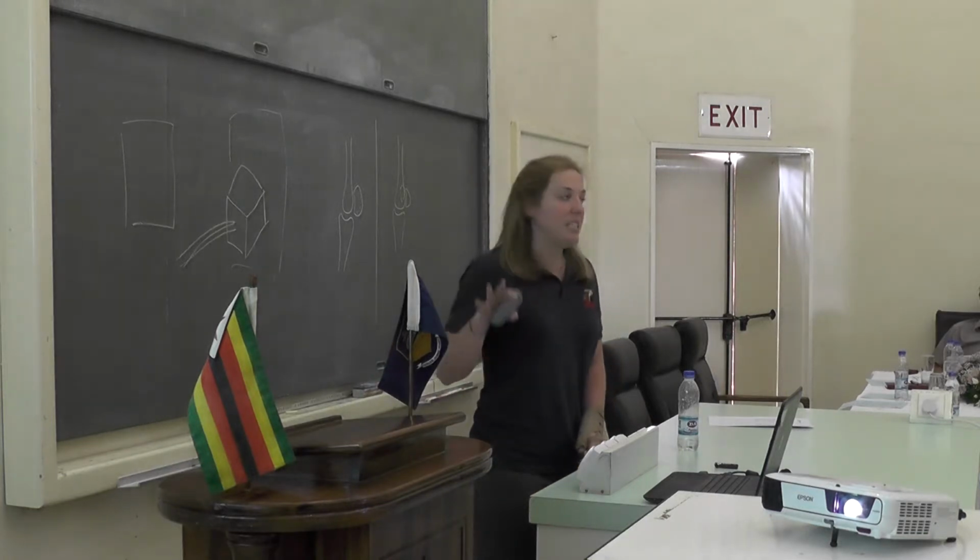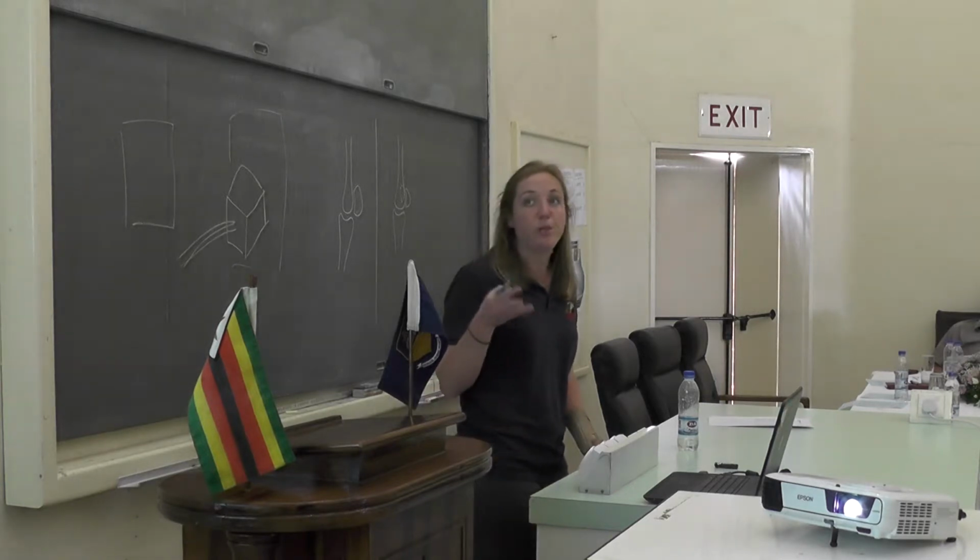And then in terms of the distal limb imaging positioning, which is what we're going to talk about in this lecture, we have two rather basic ones, which are this rather long name, dorsolateral palmaromedial or plantaromedial oblique, and the dorsomedial palmarolateral or plantarolateral oblique. It's a mouthful, that's why we shorten it to DLPMO or DMPLO.